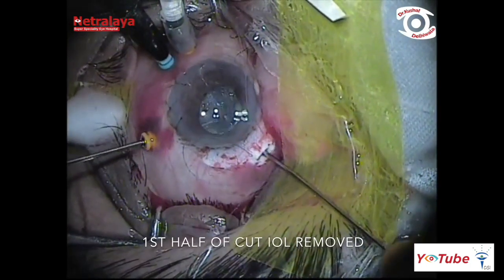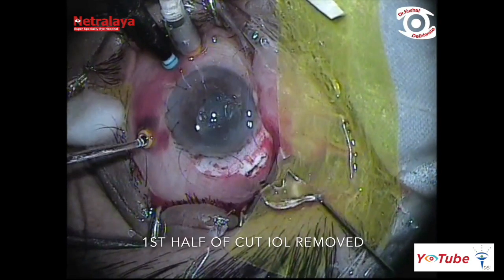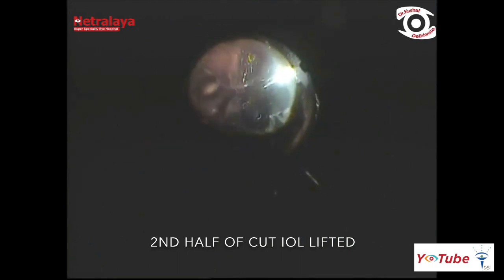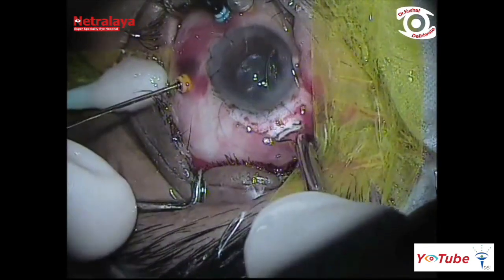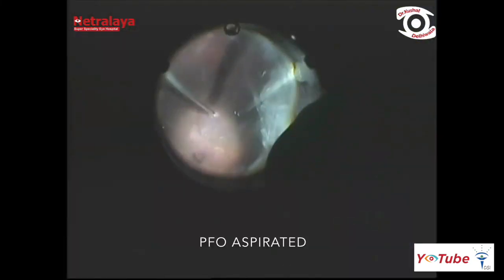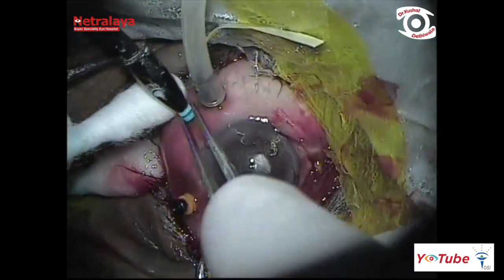Each half of the cut IOL was removed one-by-one through the 3 mm pars plana incision using intravitreal forceps. Subsequently, the supranasal incision was closed with a single 7-0 Vicryl suture. Perfluoro-octane was aspirated and prophylactic cryotherapy was applied supranasally, and all ports were secured.